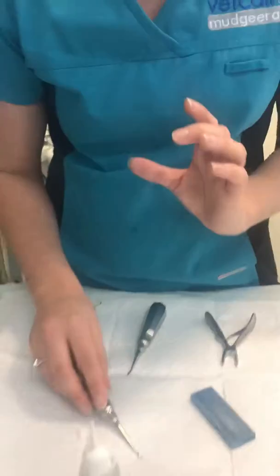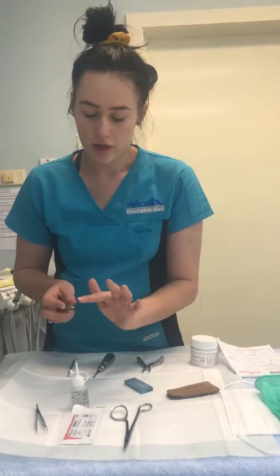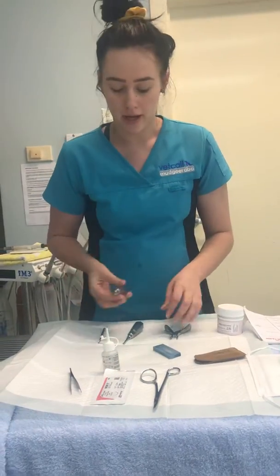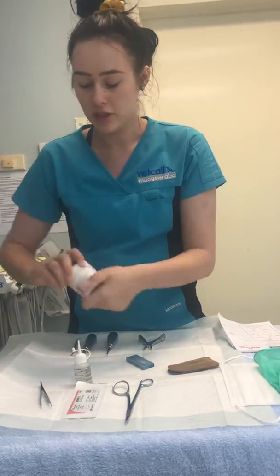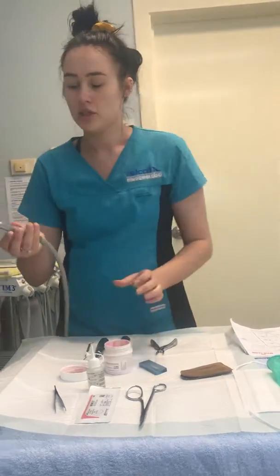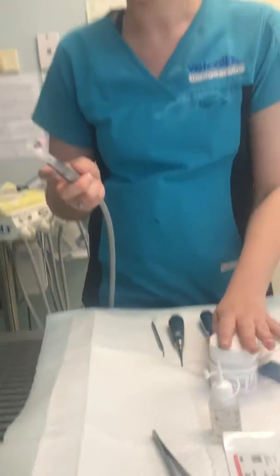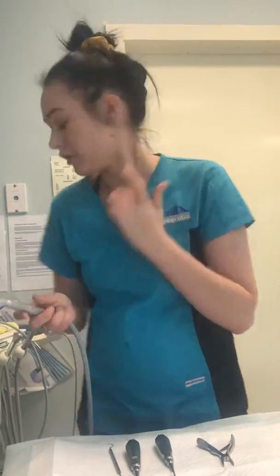And then I just like to wipe and just make sure you can feel any sharp edges, and the vet will let you know when they're doing the extraction if it needs to be sharpened again. Also too, I just have some Profi paste here, just to put into the oscillating cup like this, just to polish the tooth there. Now the reason that we polish is just to create a smooth surface on the tooth, so that way no more tartar or calculus can build up on that tooth.